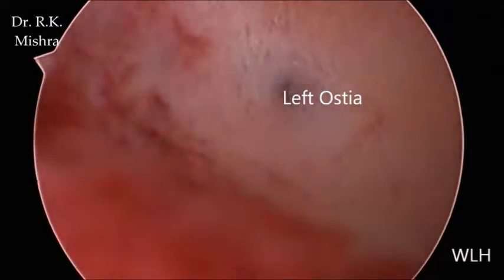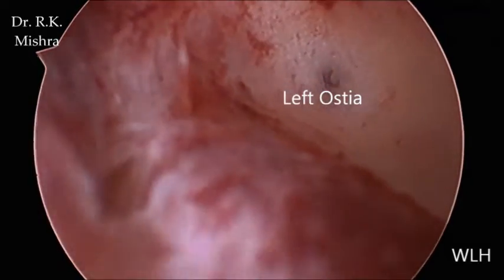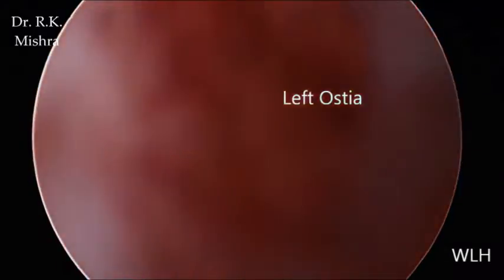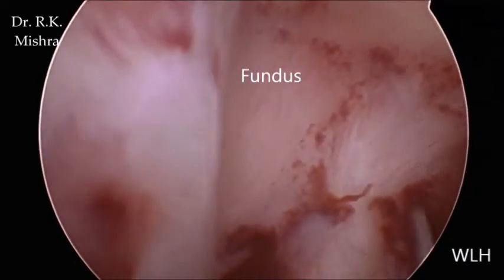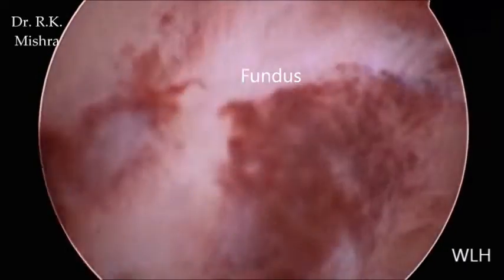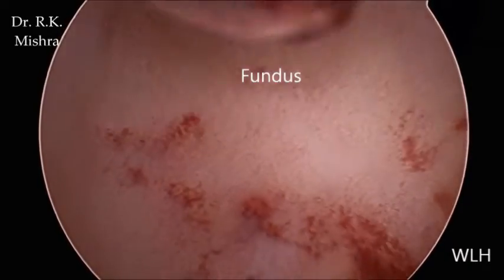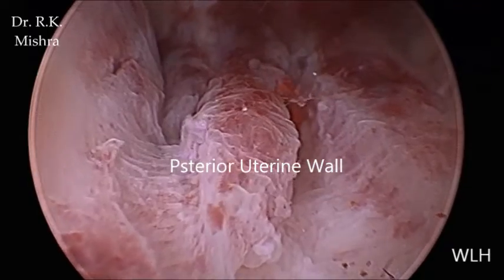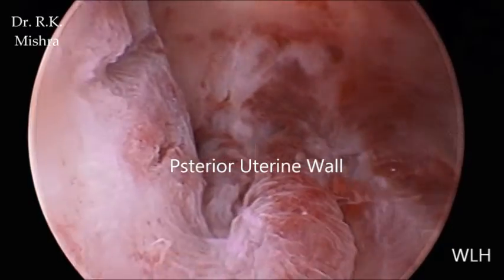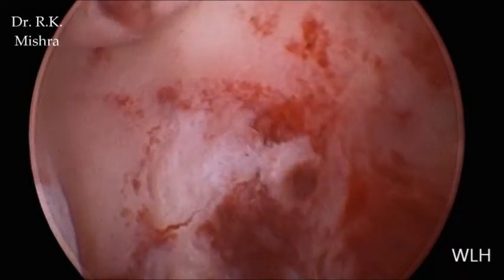This is the left ostia, and the pressure is increased a little bit. Now this is the posterior wall, this is the fundus, and here a few bubbles are there. This is the posterior wall of the uterus — this is normal.